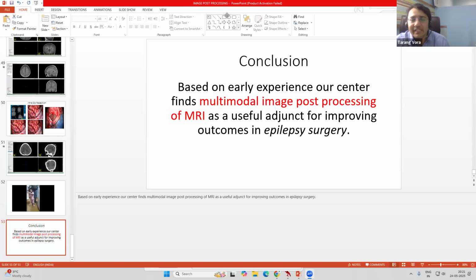We are not only dealing with dysplasias; we do a lot of stereo EEG. Sometimes this multimodal image processing leads to nothing, and we are stuck. Multimodal image processing is showing us something, the localization from a clinical point of view is somewhere else, and the EEG is showing us somewhere else. It is sometimes a mess. We then end up putting electrodes in the brain to get a more definitive answer as to where the seizures are starting from. Sometimes in spite of all that, everything fails and we just give up and say, maybe you come back after 6 months, and then we rediscuss the case.